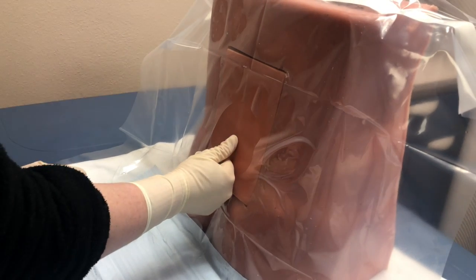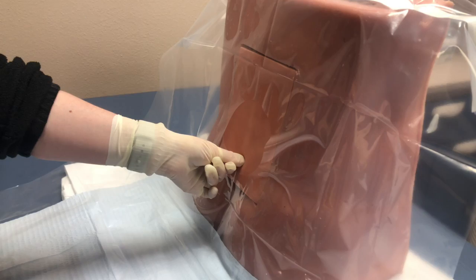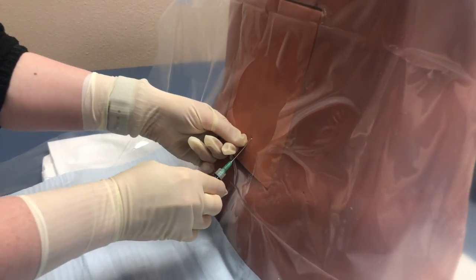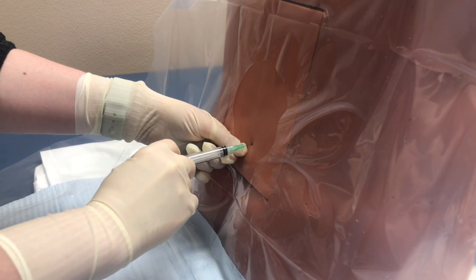Re-identify your anatomy. A rapid-acting local anesthetic such as 1% lidocaine is used for local infiltration. Raise a skin wheal to place the local anesthetic into subdermal tissues most likely to contain nociceptors. Deeper tissues can be anesthetized by spreading local anesthetic through the tissues in a fan-like pattern.